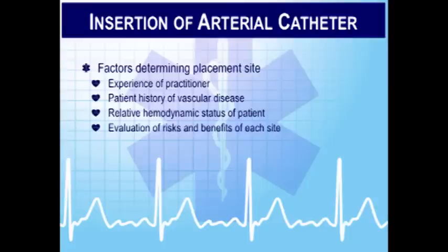In an ambulance where you're watching the patient, you catch that right away. In an ICU, when you have 2 patients and you're stuck in another patient's room for 2 hours, if that art line became disconnected for 15, 20 minutes, you'd have a big puddle of blood in the bed. Trust me, I've seen it happen. Most of the monitors in the ICU now have an alarm system on it that when it suddenly recognizes that the pressure is lost, it crisis alarms, so it brings your attention to it right away. Transport monitors are not so sophisticated like that, but you're right there.